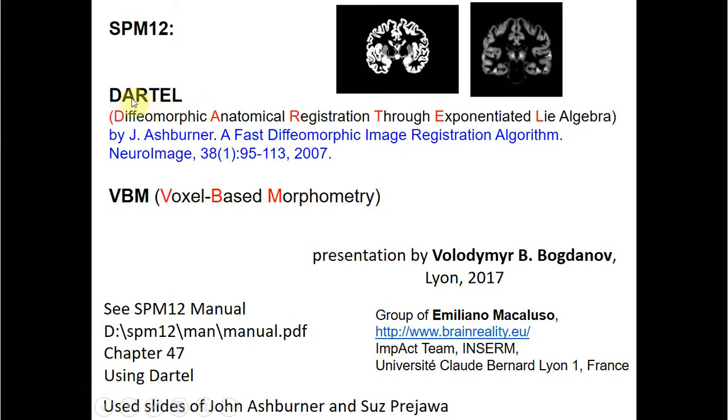DARTEL is a tool created by John Ashburner in London. The mathematics behind it is quite complex, and this is what I am not going to discuss today because I don't understand it. But I will try to share with you practical approaches and the very basic guidelines: how to start using it, why it is useful, and what you can get at the end.